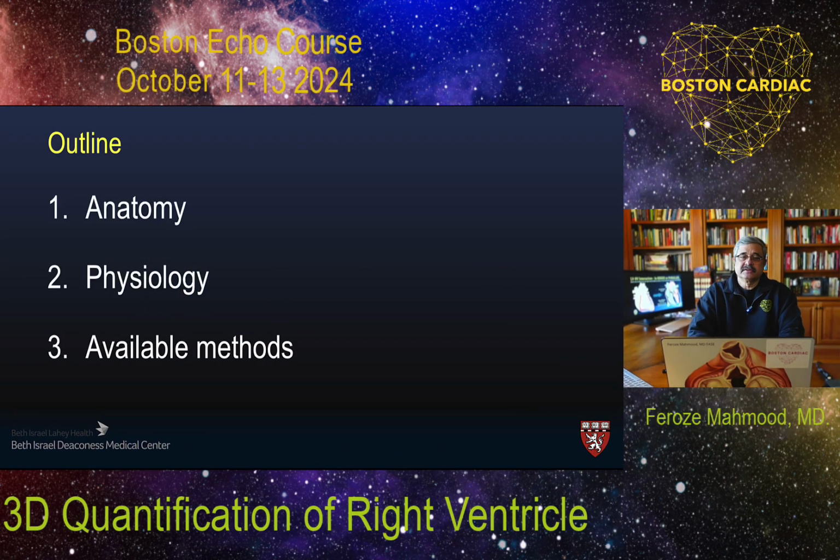So the outline of our talk is very simple. We're going to go over the anatomy, the physiology, and the available methods of assessment of three-dimensional imaging as well as three-dimensional quantification of the right ventricle.